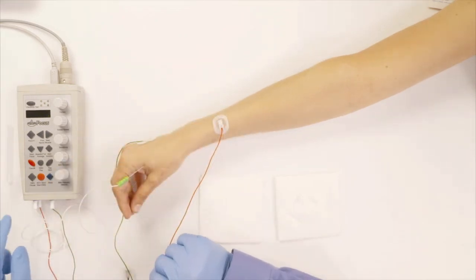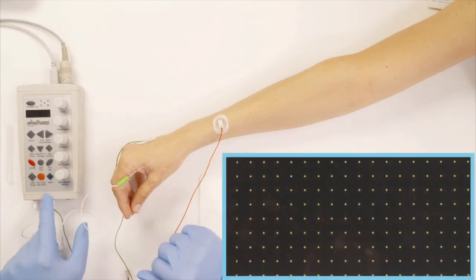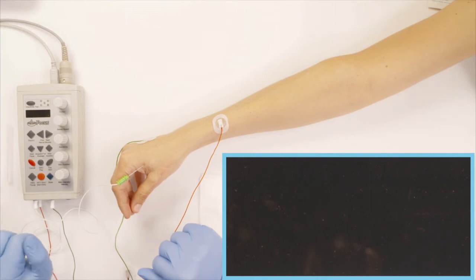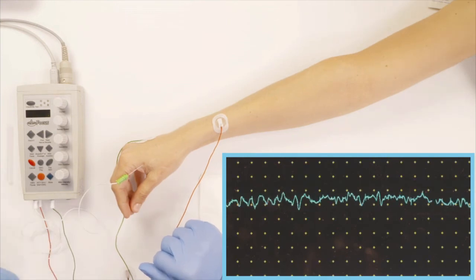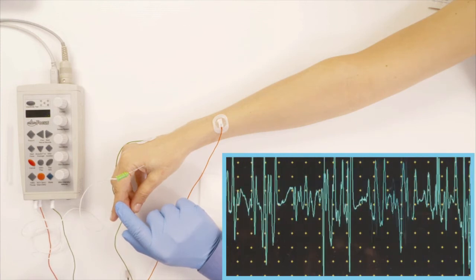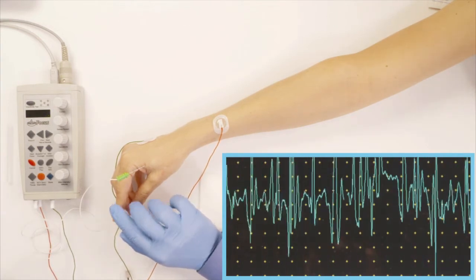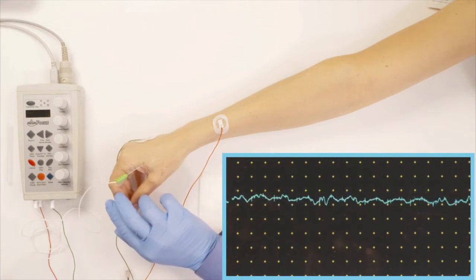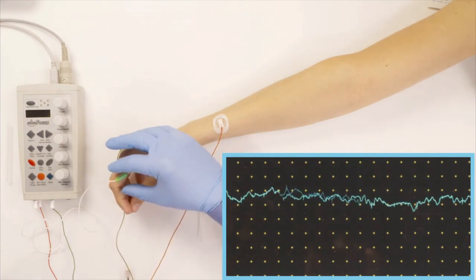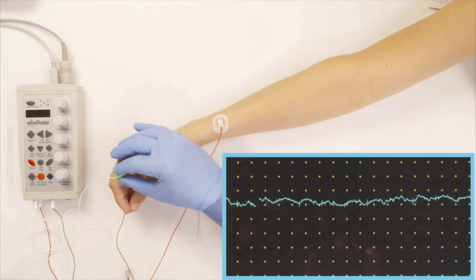And now we're going to see the activity of the muscle. So the button that I press here is called EMG play. I'm going to press that. Lift your finger up a little bit. You see now when she lifts her finger up, I can see the motor units. They're called motor units because they move the muscle. Put your finger down. And now what I need to do is actually do something we call insertional activity. Here we go. I insert the needle in the muscle.